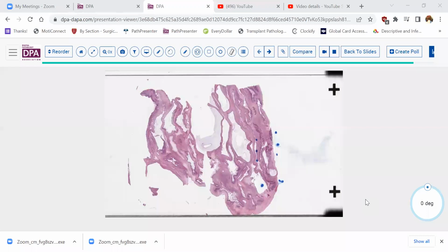Navigate through the technology. So this is a patient who is about 65 years old and presented with a pelvic mass. So a very common presentation for an older woman. And it was of a size that you sometimes certainly think about the possibility of malignancy. And as you can see here, you might predict that this lesion had a heterogeneous appearance on either radiology, either MRI scanning or on ultrasound. You've got some cystic spaces and some solid areas in between.